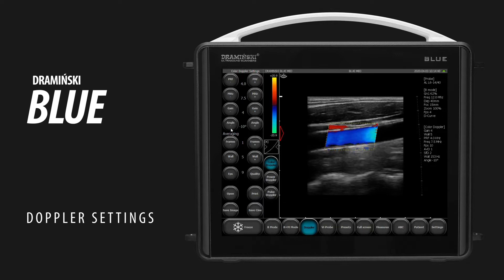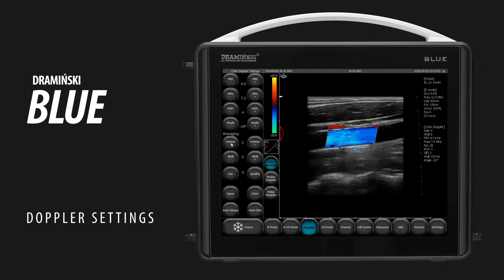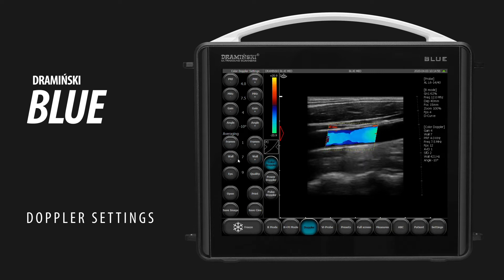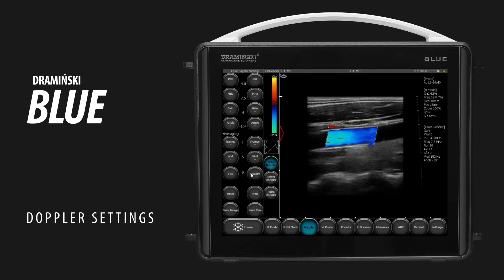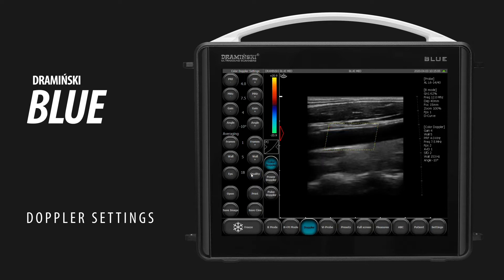The color can be displayed after averaging from a few frames. Use the Wall Filter to erase the color originating from the movement of the tissues. Use FPS quality to set priority for image frame rate or Doppler sensitivity.